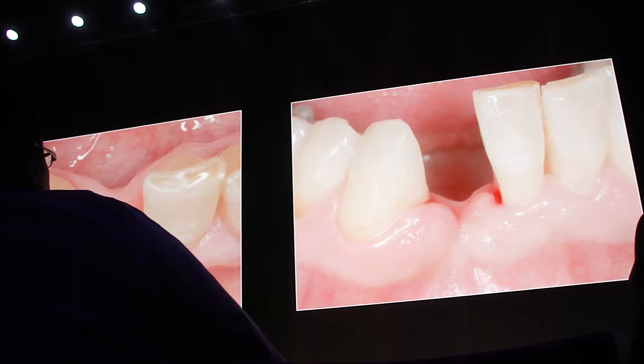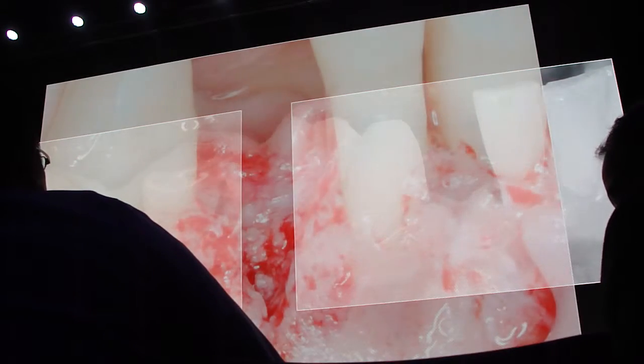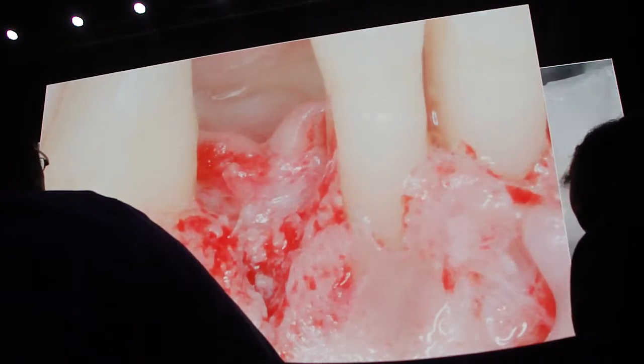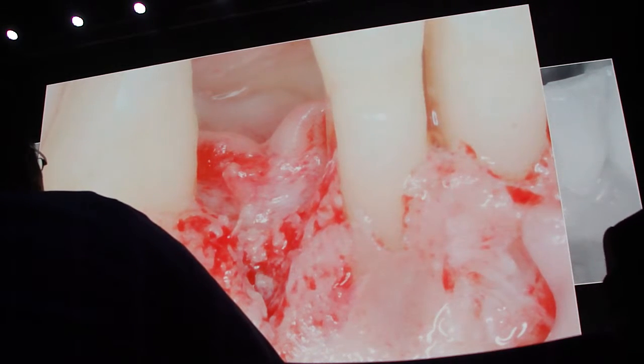But what about the lower front? Well, the lower front is one of the most demanding situations from a biological point of view because of the very limited biological space, limited space for placing an implant and to create new tissue. So especially in those cases where we have vertical defects and missing bone on the adjacent teeth, we actually go for a 2-stage procedure from a biological point of view to create enough contact to this little recipient site.